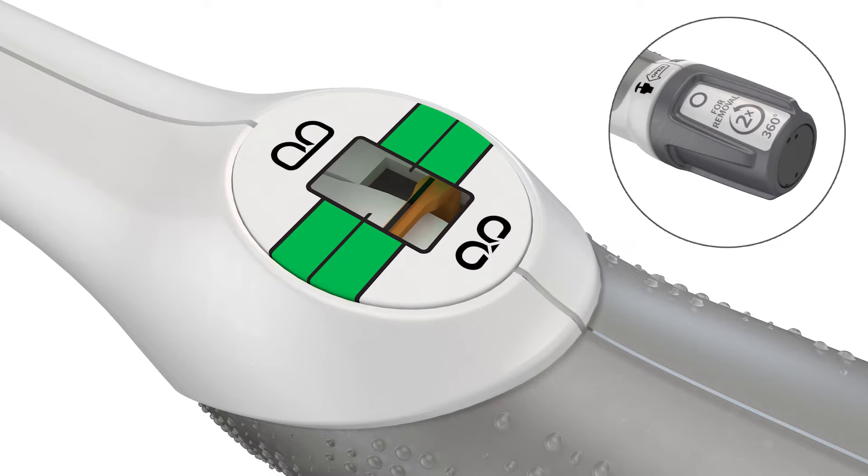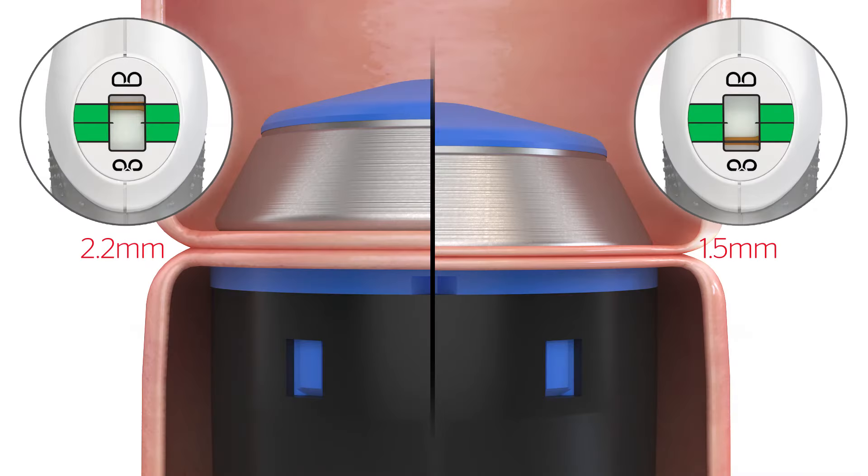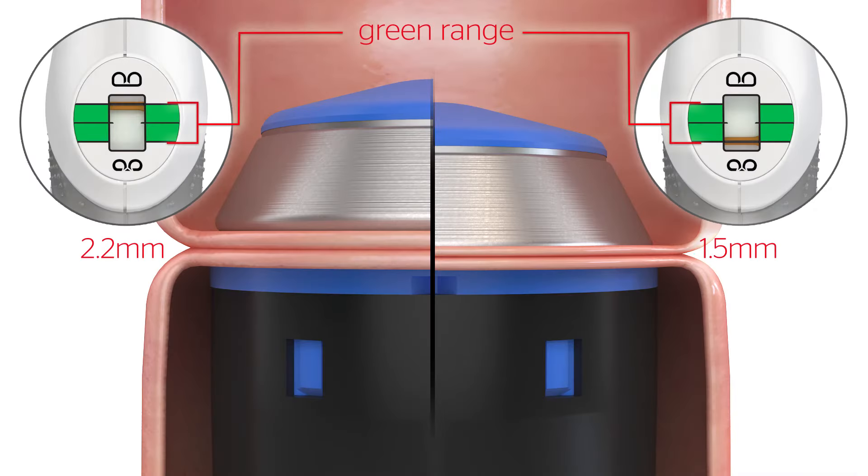The device will form staples at the height matching the compression applied during closure. If the indicator is not in the green range when fully compressed, the tissue thickness exceeds the indicated range of the stapler.